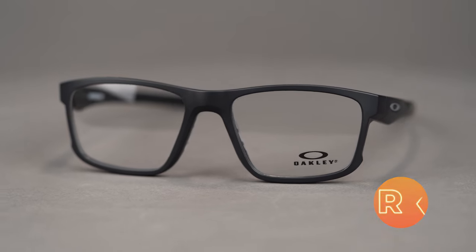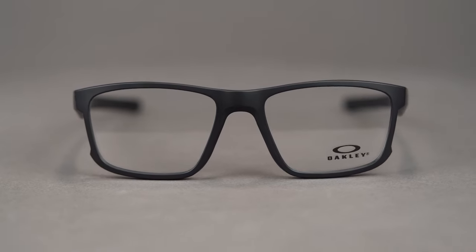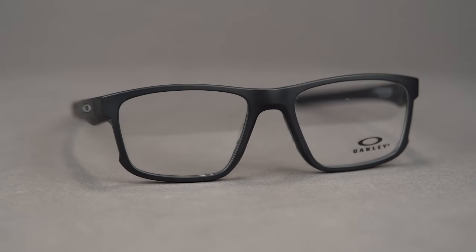The Hyperlink comes in a variety of colors and holds a range of prescriptions including progressives. You can even get it with Oakley authentic digital lenses or build your own custom lenses from the SportRx options. You can get the Oakley Hyperlink online today at SportRx.